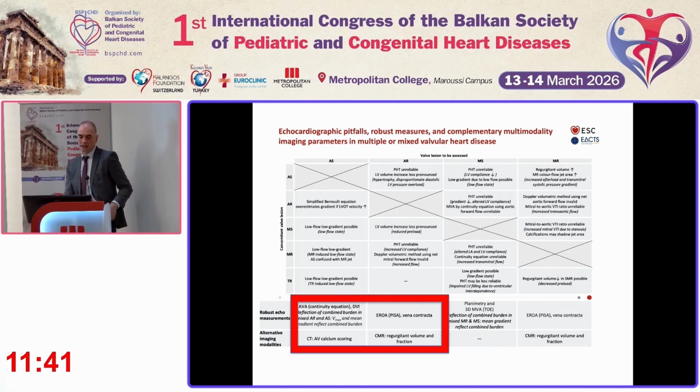the MRI can provide accurate volumetrics. It's also the exam of choice, we'll discuss that a bit later on, for ejection fraction and dimensions assessment. Is it a matter of numbers solely? No, but they are still key components of our decision making, and quite frequently we are in need of accurate numbers.